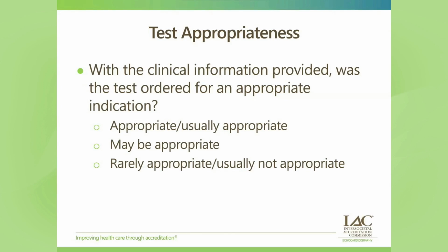So if this is a patient coming through the pediatric echo lab for some reason, you would still see this question. So we've been given our clinical information, and then the answers to our question are, is this an appropriate indication for an echo? Maybe it's appropriate, or rarely appropriate, or not usually appropriate.